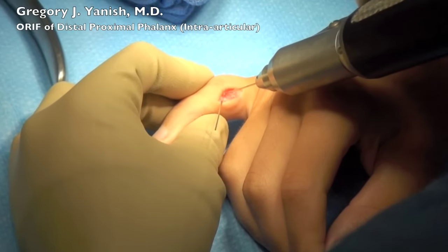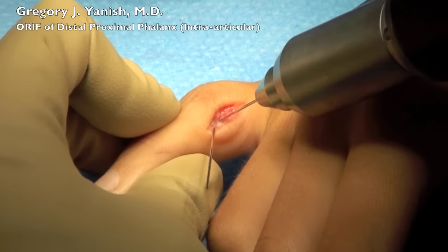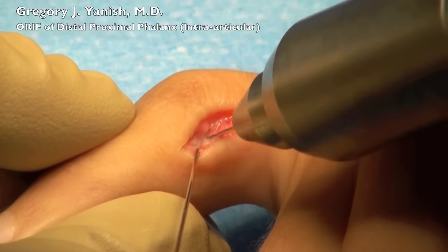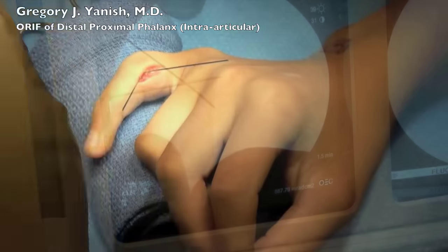There is some erosion in the middle of the joint surface that is secondary to the delayed presentation of this patient. A second K-wire is then placed in a criss-cross fashion. This gives some stability to the K-wires, and you can see the positioning there on the fluoroscopy.